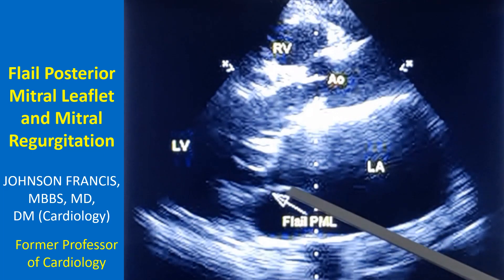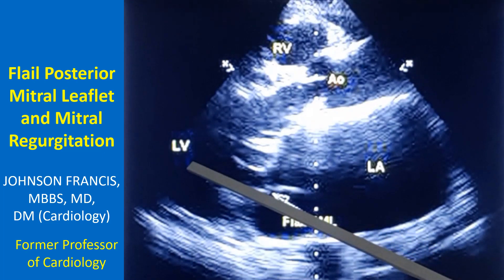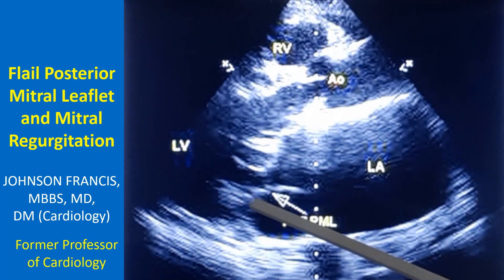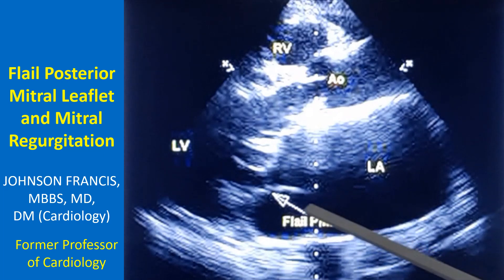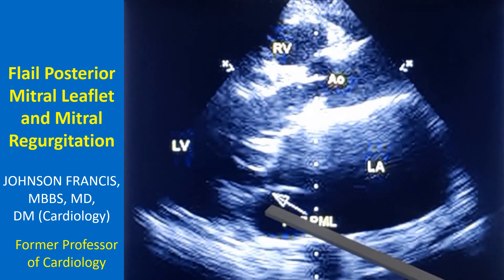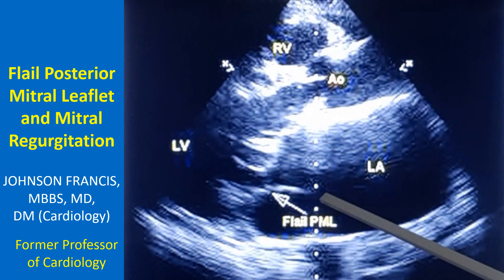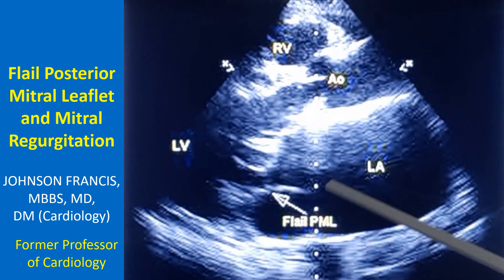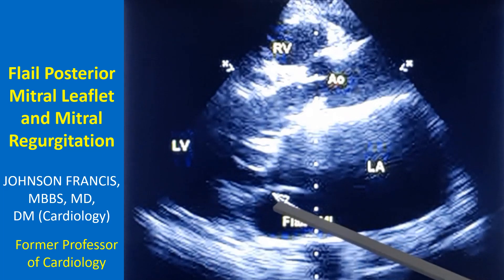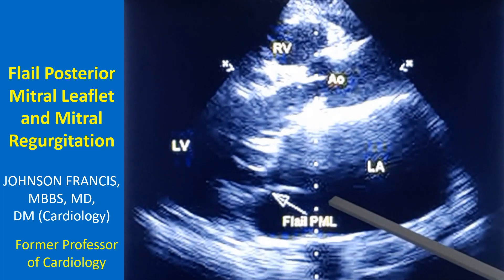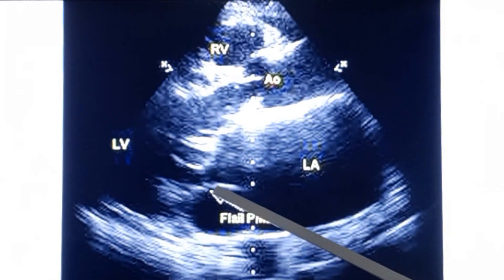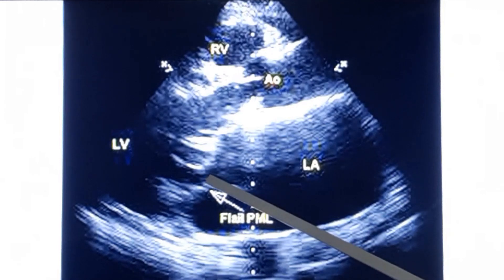The posterior mitral leaflet is seen pointing towards the left atrium because it is a flail posterior mitral leaflet. Normally during systole, the leaflets are pulled into the ventricular side by the contraction of the papillary muscle and the chordae tendineae are taut. When the chordae tendineae are ruptured, the leaflet becomes flail and points towards the left atrium in systole due to the force of pressure in the left ventricle. Rising pressure in the left ventricle causes the flail leaflet to point away from the left ventricle into the left atrium. There is a gap between the anterior and posterior mitral leaflets, which causes mitral regurgitation.